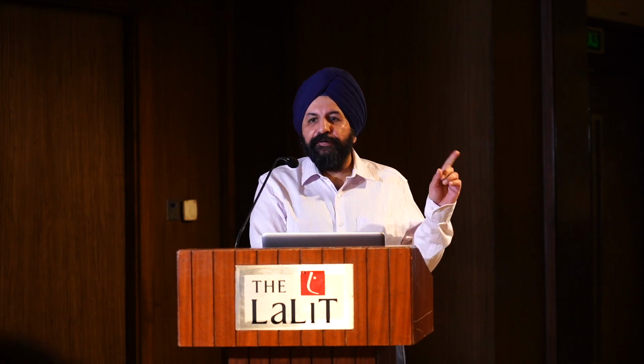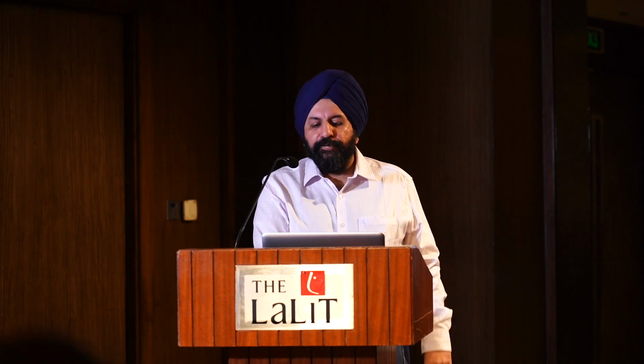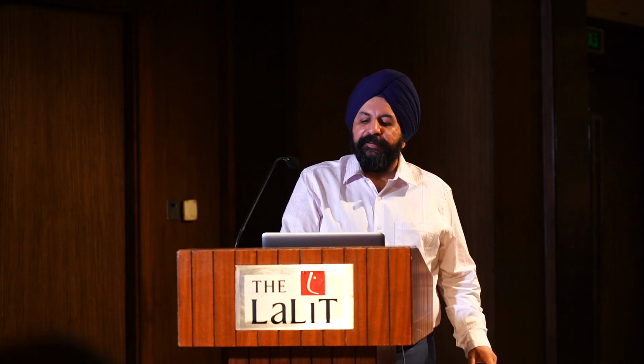And there was a previous study from Hinduja which said IPF of 10% can be used as a cutoff. So we kind of juxtaposed that theory, saying that a single IPF more than 10% is not a reliable marker for platelet recovery. And peak IPF value in dengue patients of different ethnic groups can be a subject for further study, which it was.